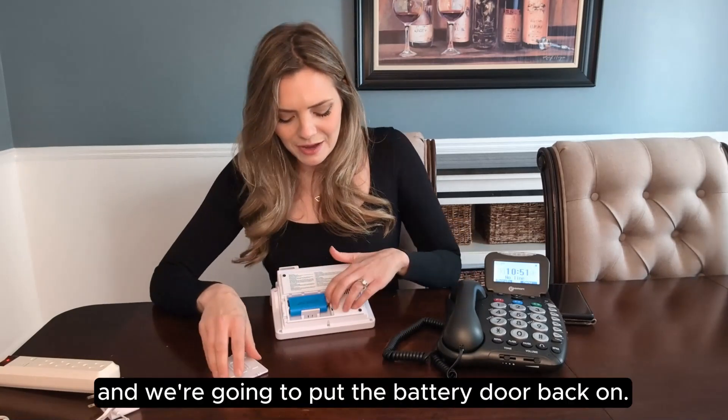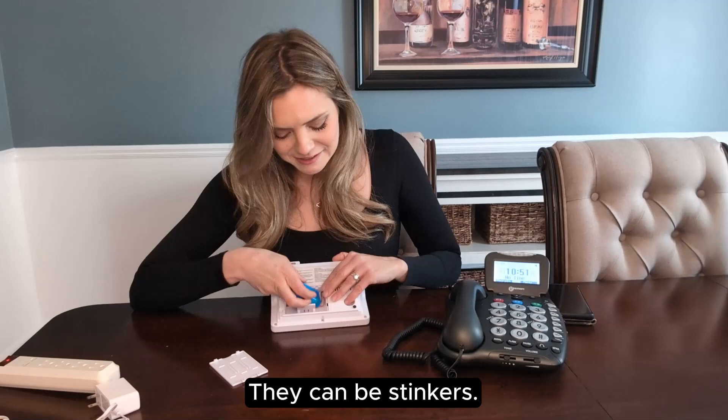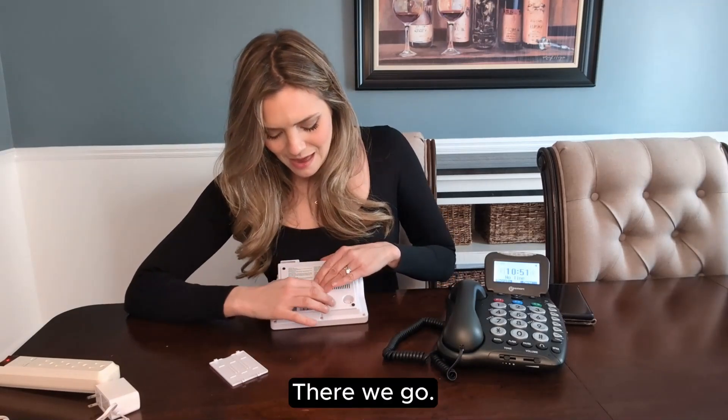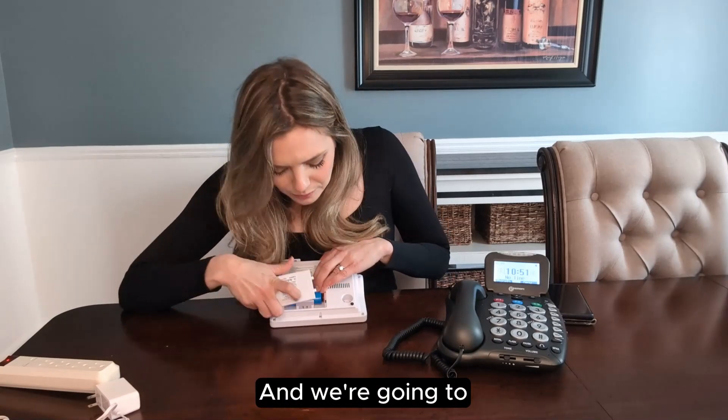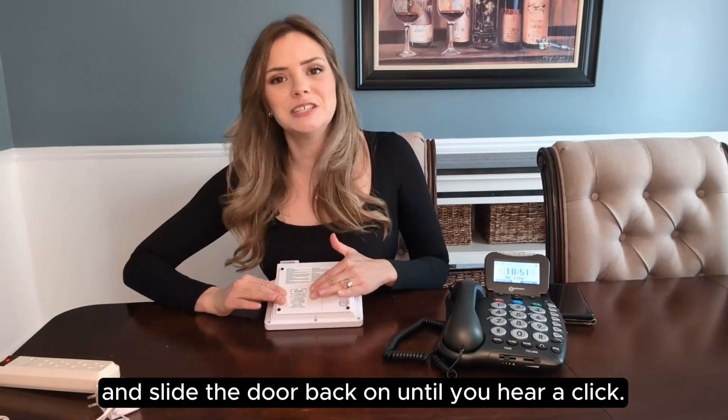Put it back in and we're going to put the battery door back on. Make sure the wires are out of the way. Put these teeth right in and slide the door back on until you hear a click.